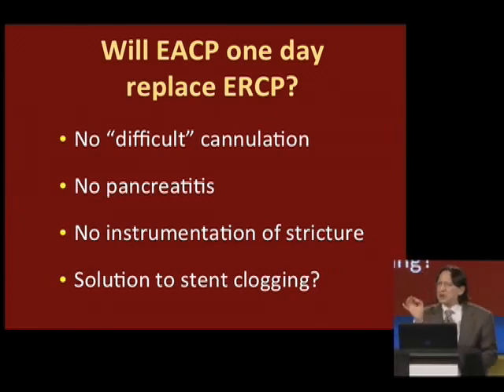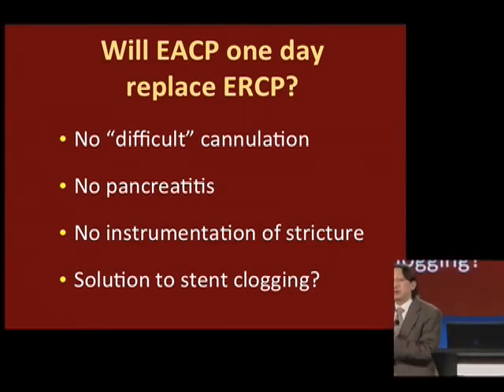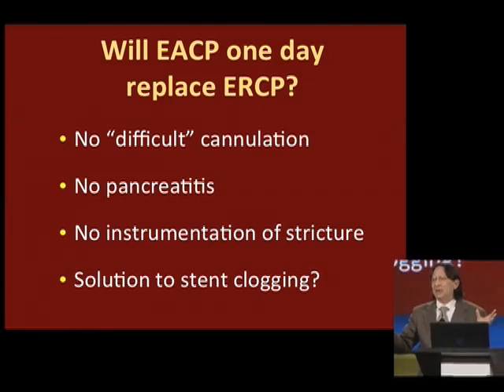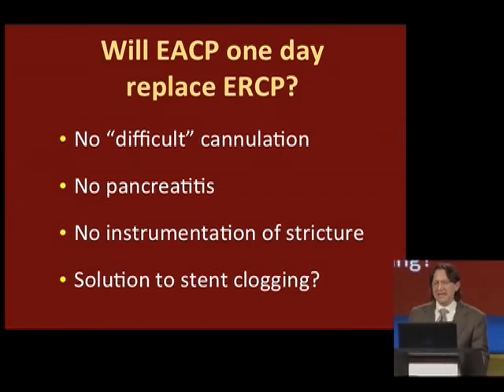There is no instrumentation of the stricture. The Japanese have always argued that every time you manipulate a cancer and pass instruments through it, you may disseminate or seed cancer cells. We eliminate that. But most importantly, could this be the holy grail we've been searching for, the solution to stent clogging?